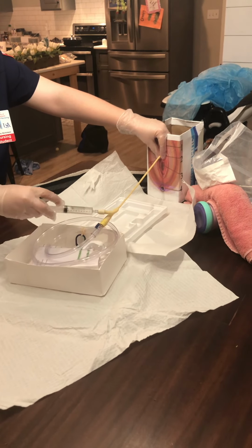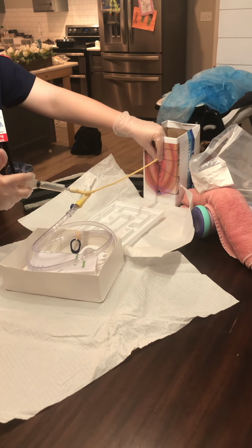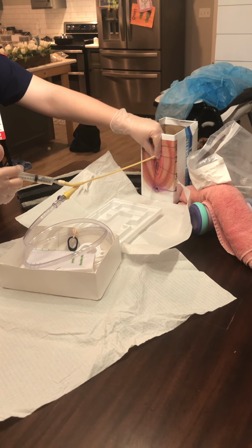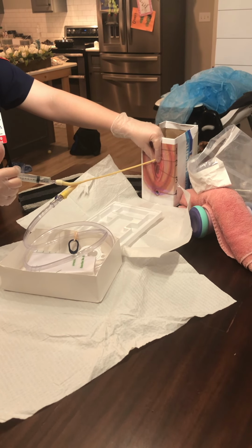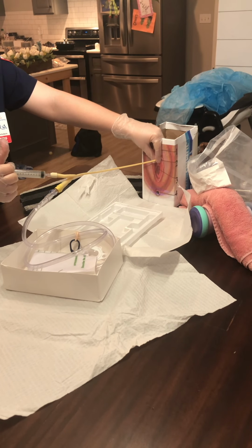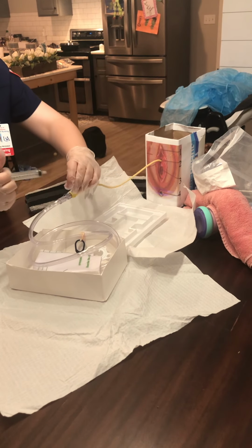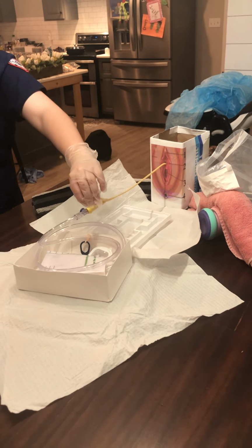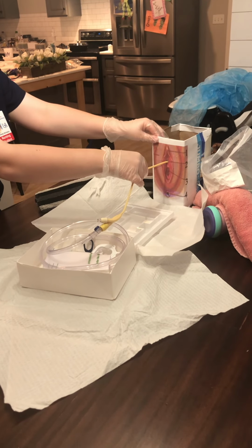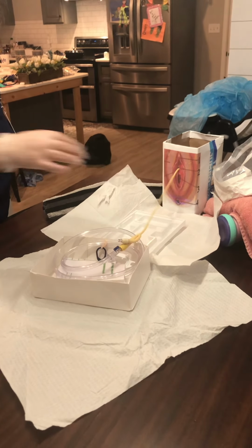And then I'm going to blow my balloon up. Okay, I'm going to hold pressure. I'm going to remove this and discard it, but I'm going to be using it in a minute. Then I'm going to gently tug, and it's still there. And then I'm going to advance 1 to 2 more inches so that it's not sitting on the bladder wall.